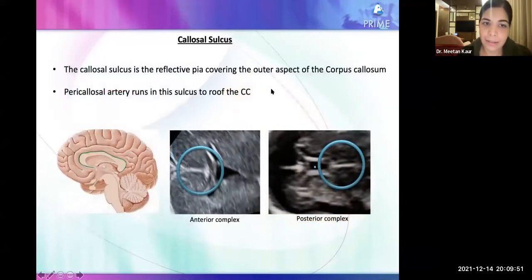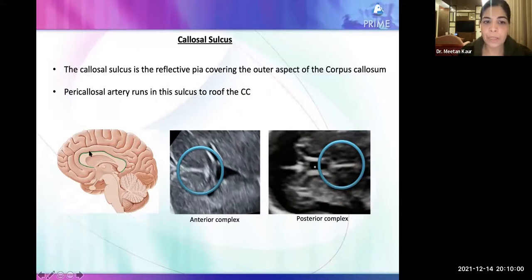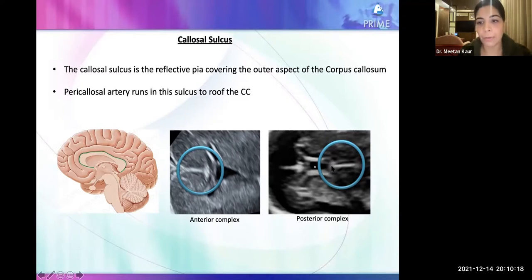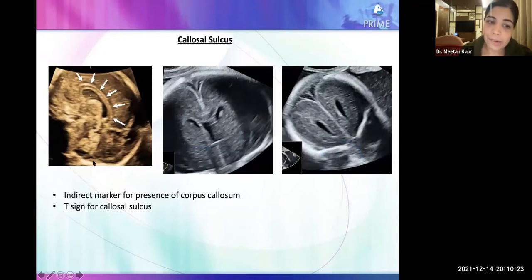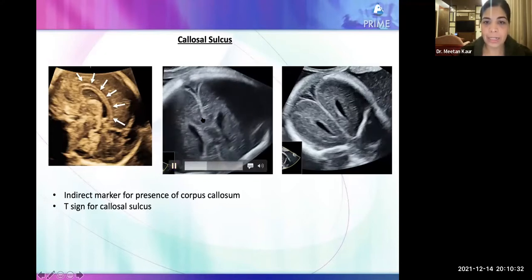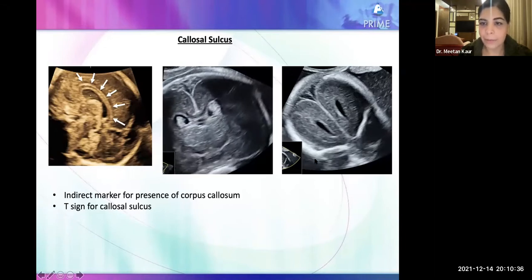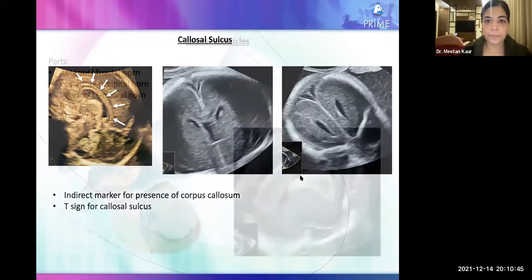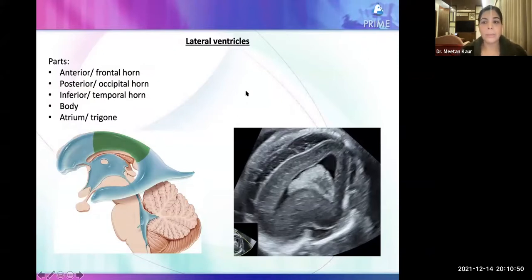The callosal sulcus is a reflective pia covering, which is why it is echogenic on the outer aspect of the corpus callosum. The pericallosal artery runs through this sulcus to roof the corpus callosum in its entirety. The callosal sulcus can be seen anteriorly as part of the anterior complex and posteriorly as part of the posterior complex. It is an indirect marker for the presence of the corpus callosum in its entirety — seen as the characteristic T sign in the transventricular view.